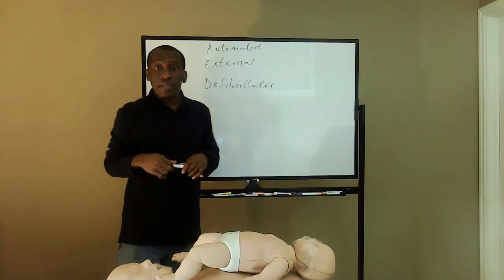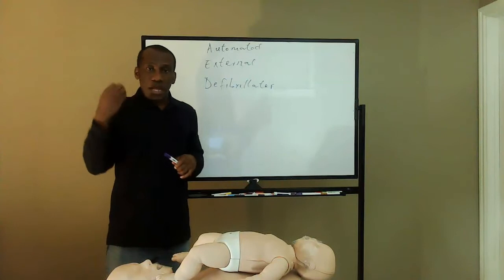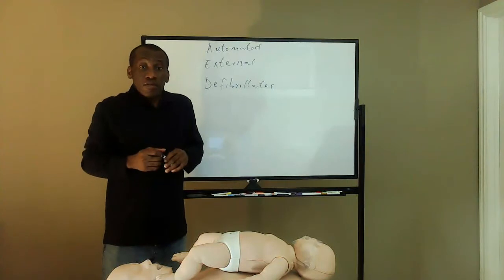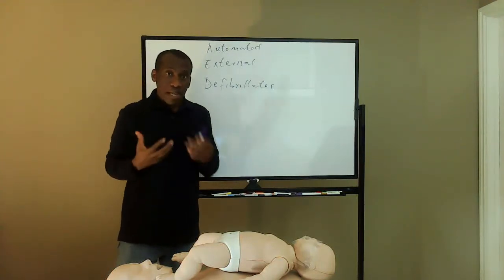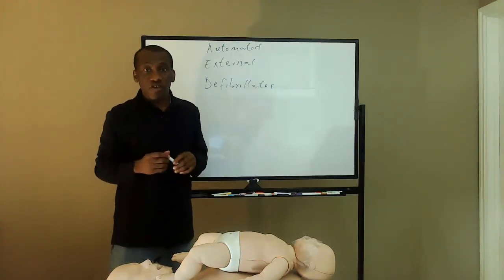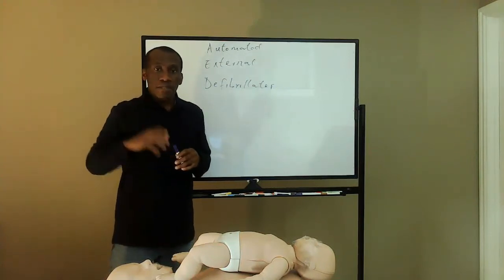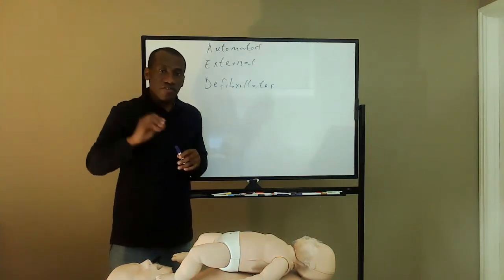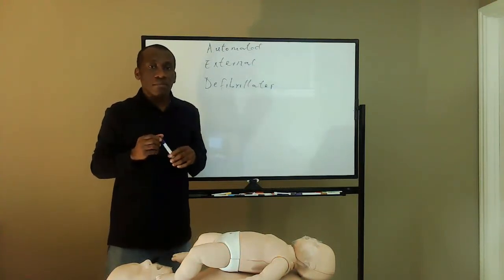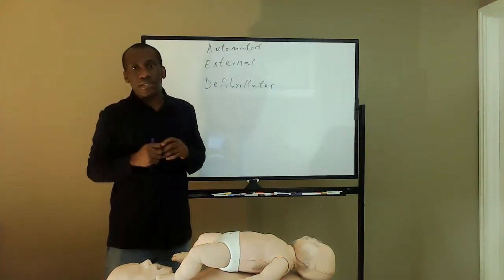So AED is a computerized device capable of detecting abnormal or irregular heart reading and can also normalize those heart readings through electrical shock. So AED can give shock, but it can only recommend shock if abnormal heart readings are detected.